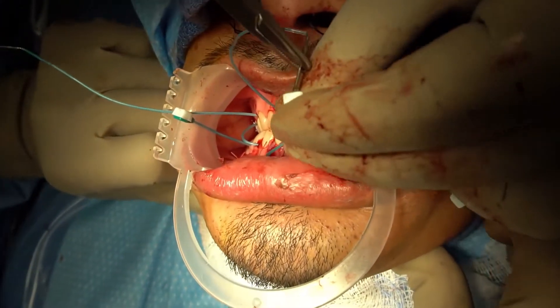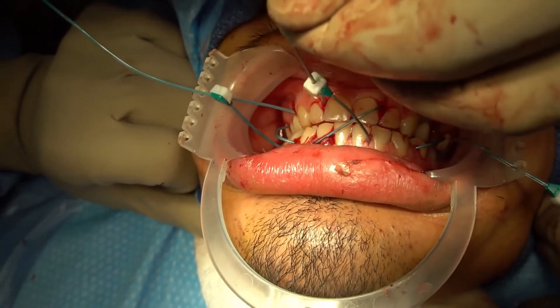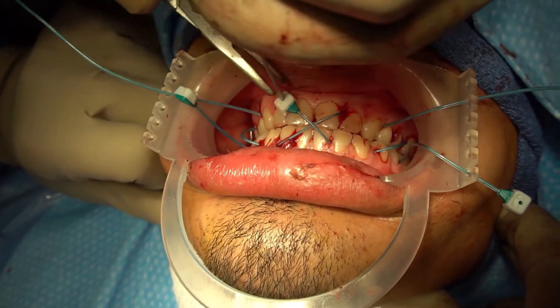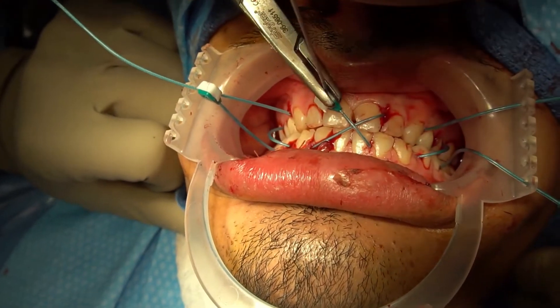Finish the figure eight by crossing diagonally and inserting the introducer into the green side of the claspbed. Leave the ties loose until all are applied. Tighten the suture finger tight by pulling on the suture while pushing the claspbed down and against the teeth. Once occlusion is confirmed, continue final tightening to ensure that there is no slack on the lingual side of the teeth.